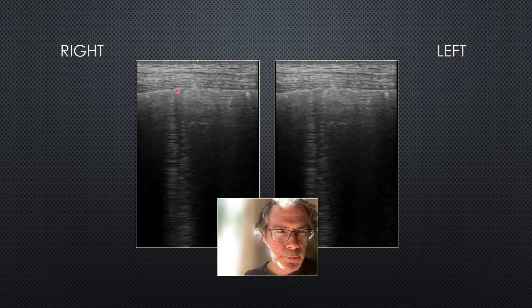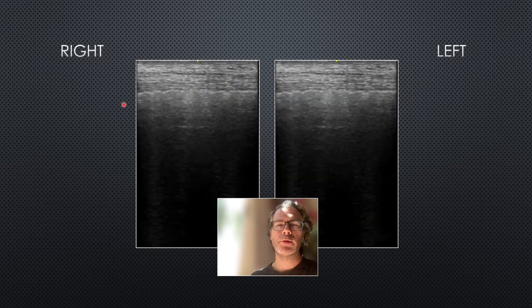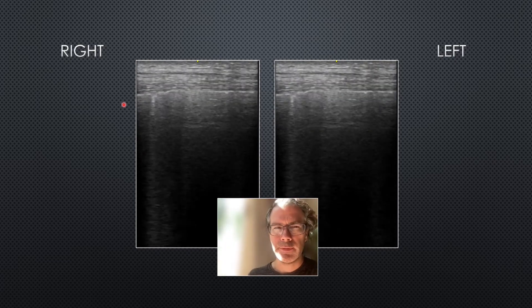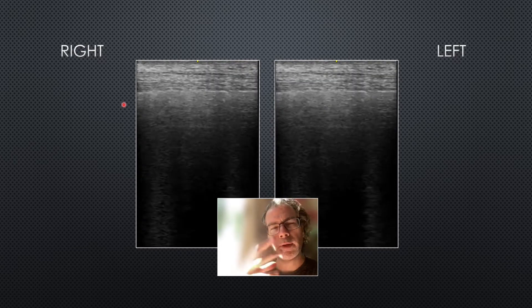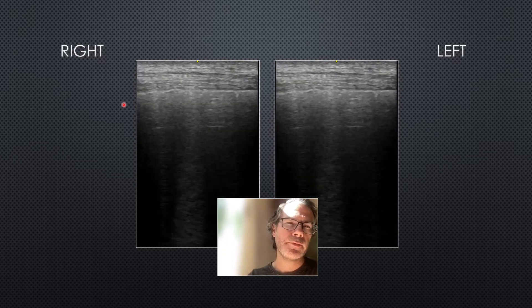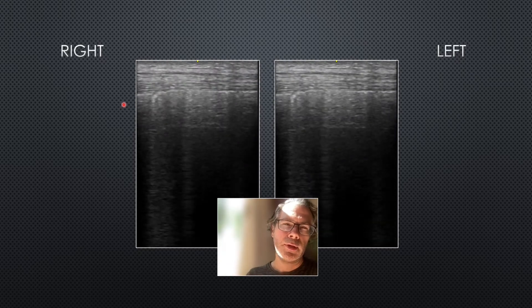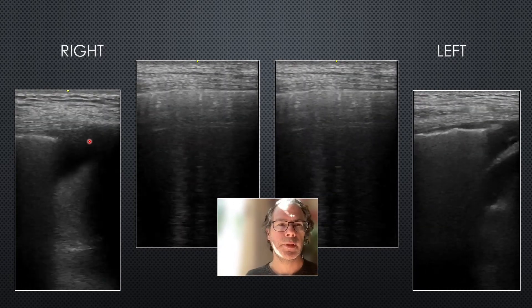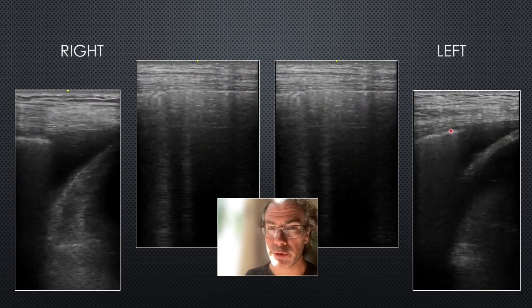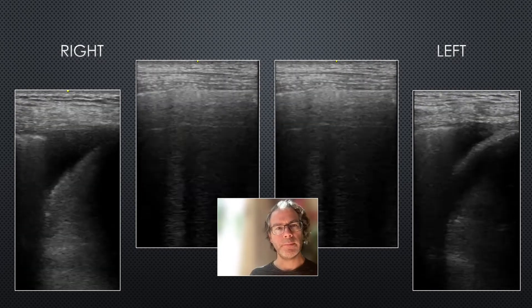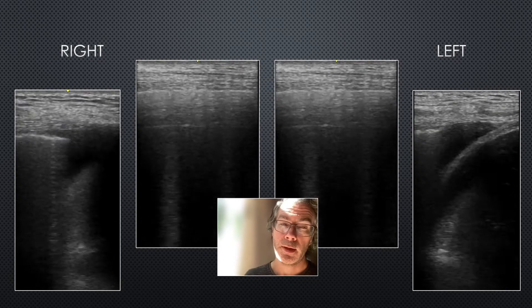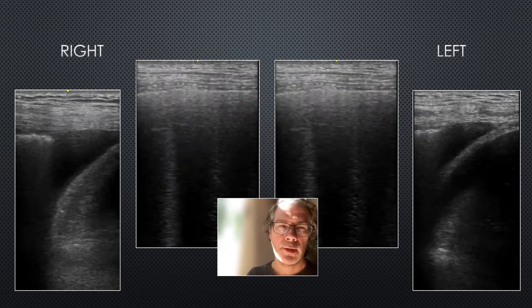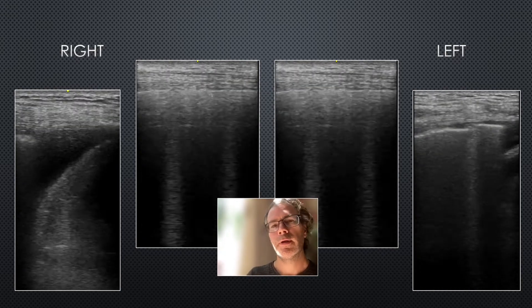There are also bright white vertical lines coming down from the pleural line called B lines. Isolated B lines are not specific to anything, but a pattern and distribution combined with other findings can be very useful. Here they are bilateral, and scanning down to the lung bases I saw anechoic pleural effusions. Symmetrical dependent B lines with associated pleural effusions, combined with poor LV function and a plethoric IVC, builds a very strong case for pulmonary edema.